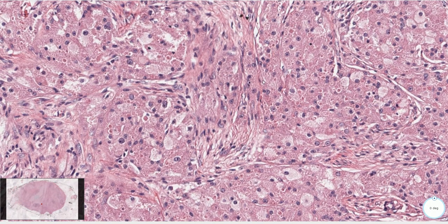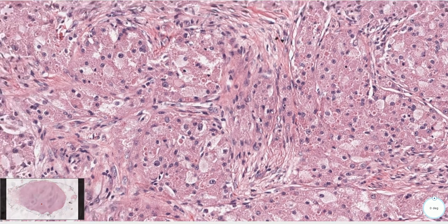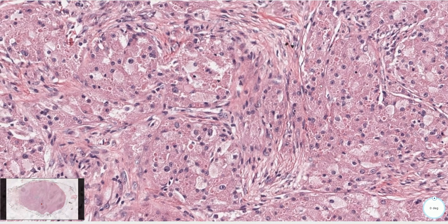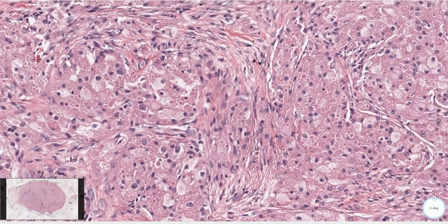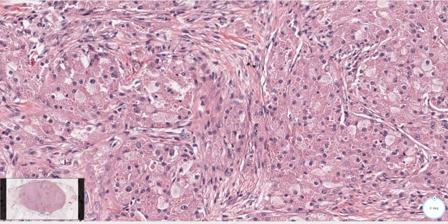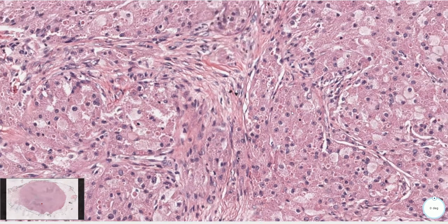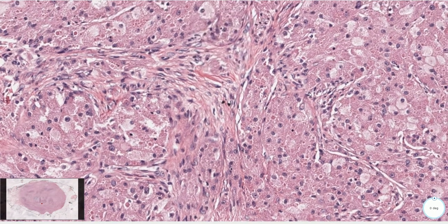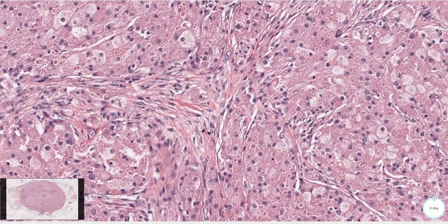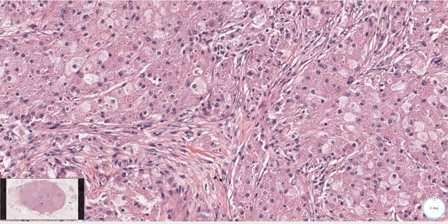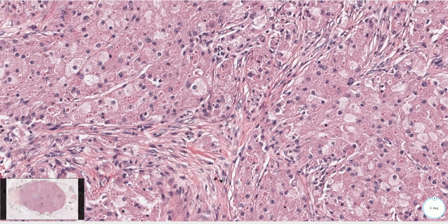The cytoplasm of these cells is packed with lysosomes, which are responsible for the finely granular eosinophilic appearance. Some of these cells may mimic histiocytes, and therefore immunohistochemistry might be helpful.